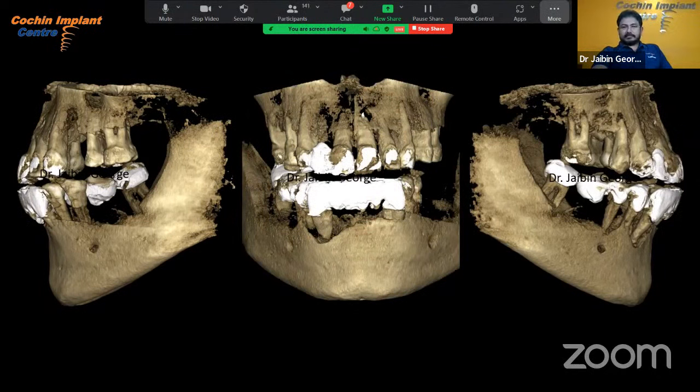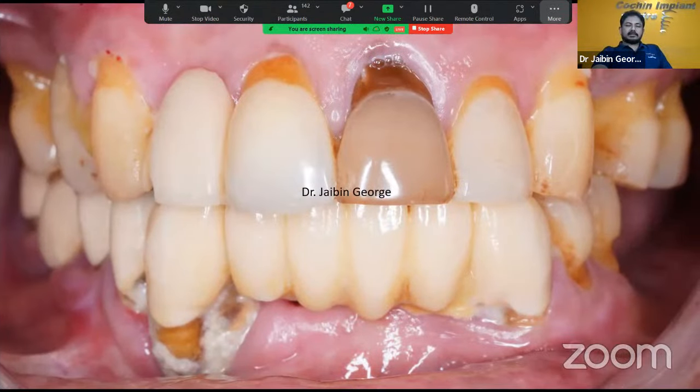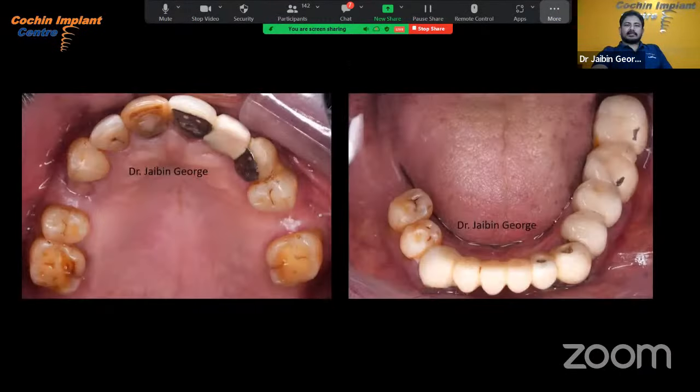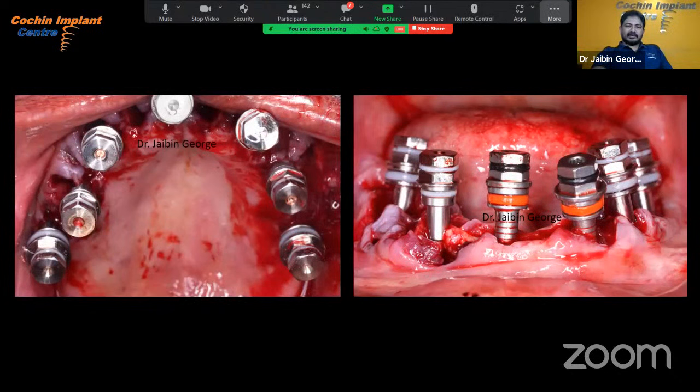This is the pre-op radiograph, I mean, the virtual models. We can see the pre-op photograph of the case. Intraoral photographs. All the teeth were extracted in the same visit and implants were placed.